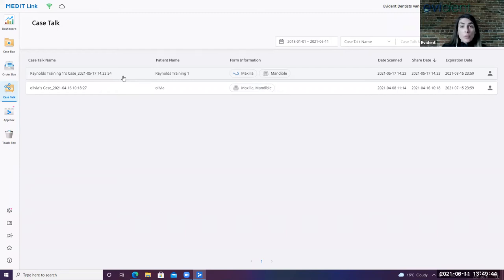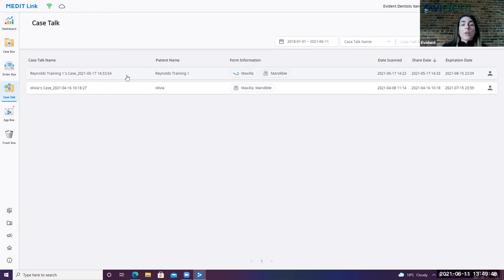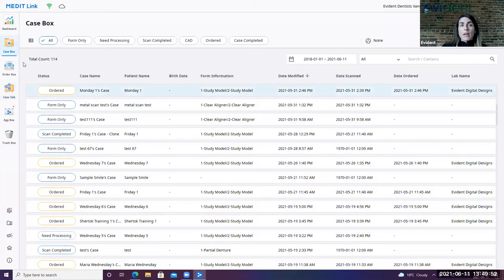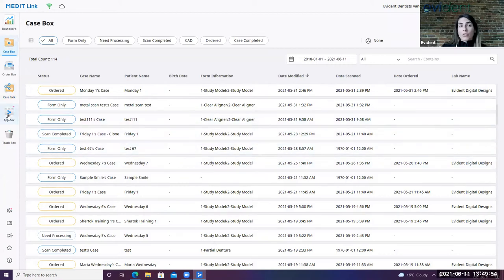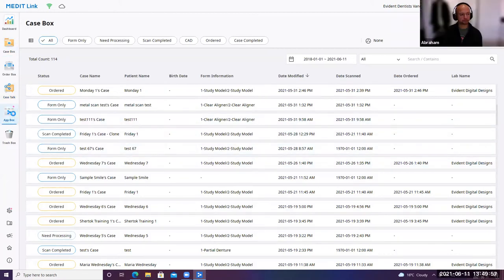They're able to view the case, they can make comments to the case, but they're not able to modify or delete the case. It's very simple. I'll show you once we get into that scanning screen what that all looks like.